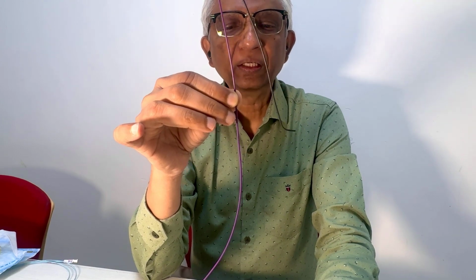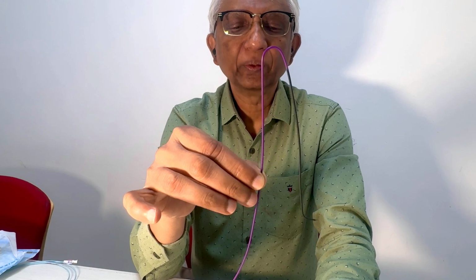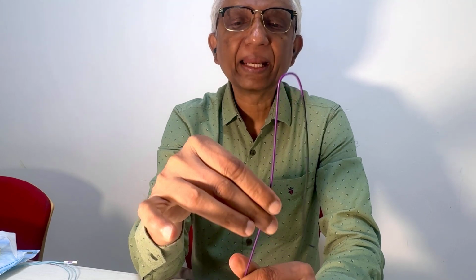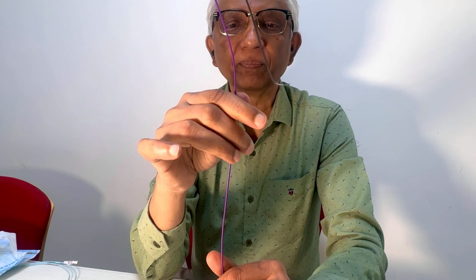Once this curve is created, you pull it down, you can enter into the internal iliac, you can enter the uterine artery, you can enter into the anterior division, whatever. But as you target, it will move. But remember, the direction is opposite. Whenever you push, the catheter goes up. Whenever you pull, the catheter comes down.